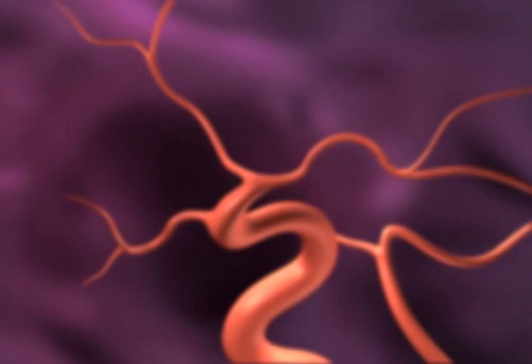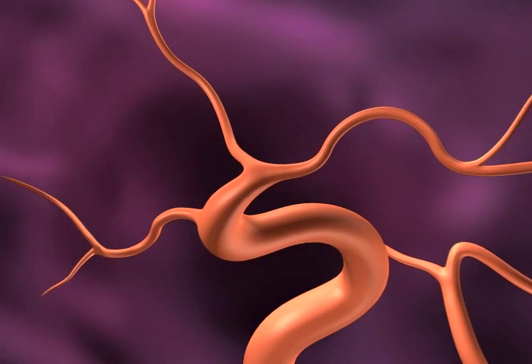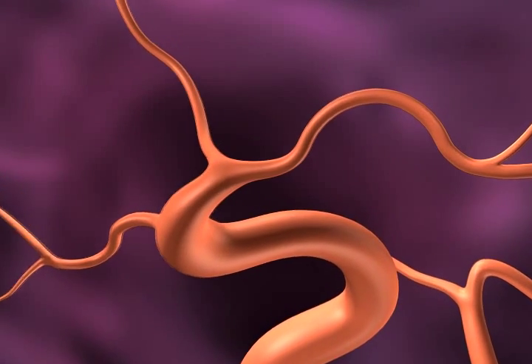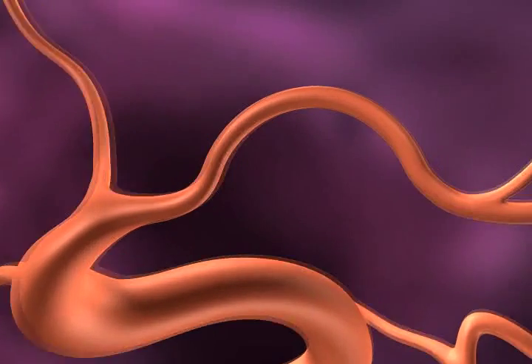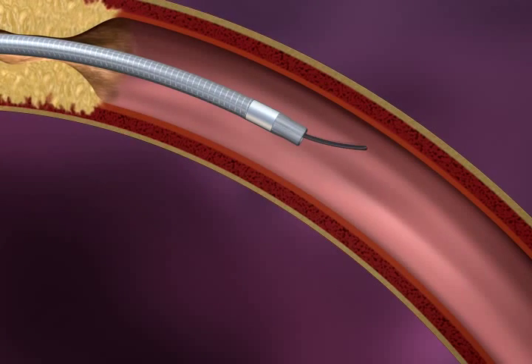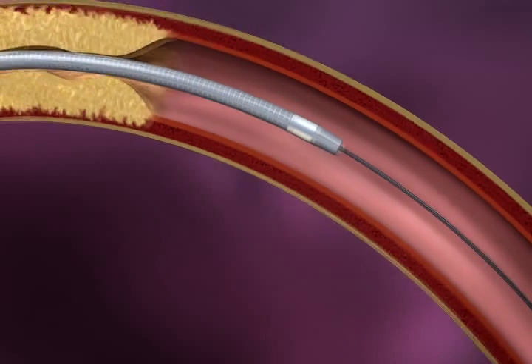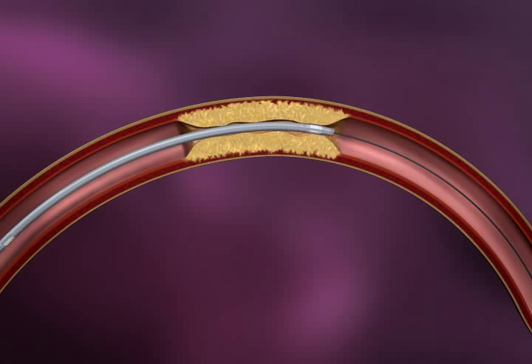The Wingspan Stent System is designed to access tortuous neurovascular anatomy. Use a .014 inch exchange length guide wire to cross the stenosed lesion. A microcatheter can be used to obtain access if desired.